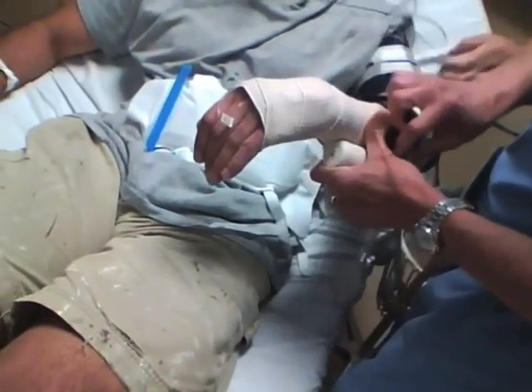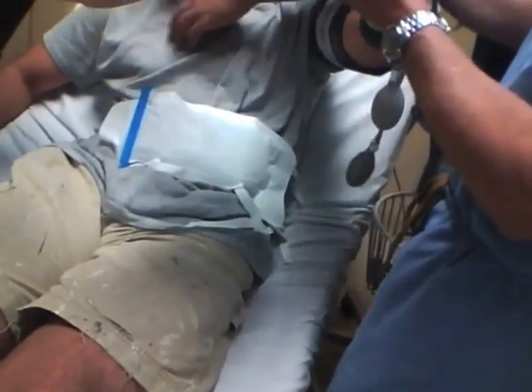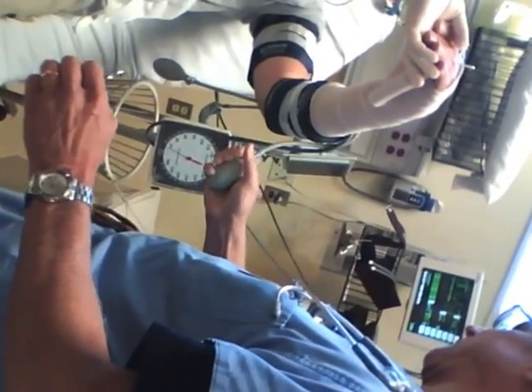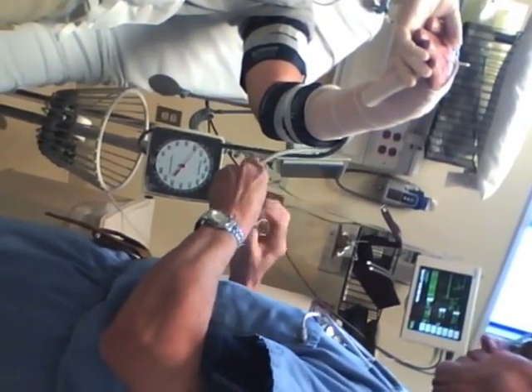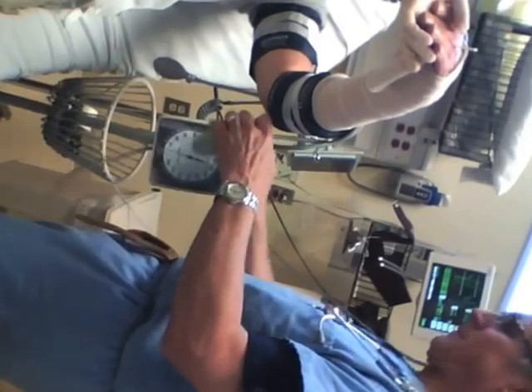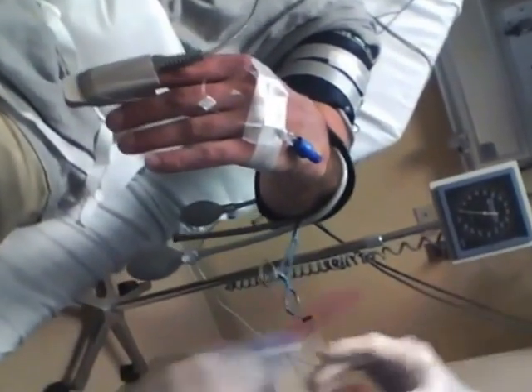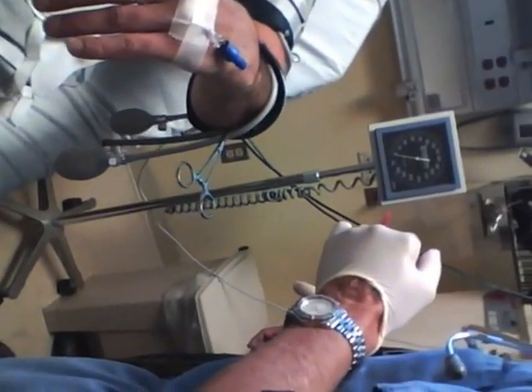The arm is exsanguinated by wrapping it with a tight elastic dressing and elevating the arm to get as much blood out as possible. Once this is done, the blood pressure cuffs are inflated to well above the patient's systolic blood pressure. As you can see, the manometer is going around once and beyond on this patient and the tubing is clamped — it is imperative to ensure the tubing is clamped. Once that's done, the manometer can be disconnected. The wrapping is removed, and lack of a pulse is documented through use of a pulse ox, which shows no waveform.